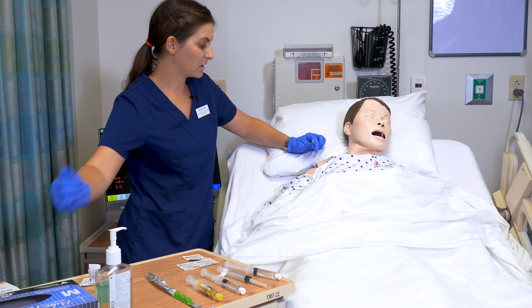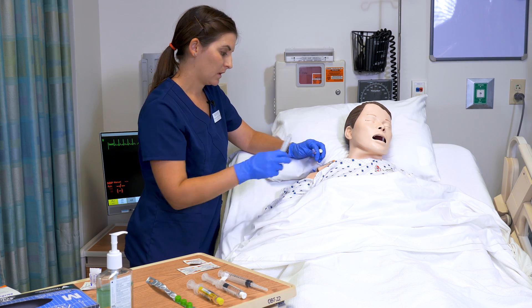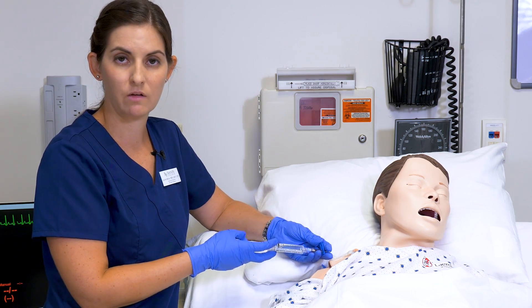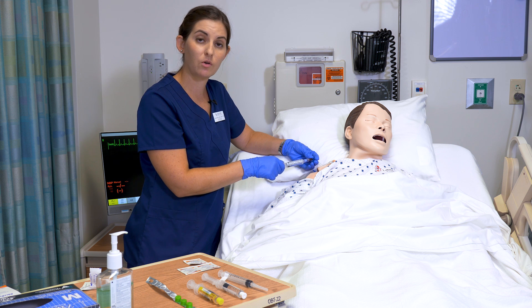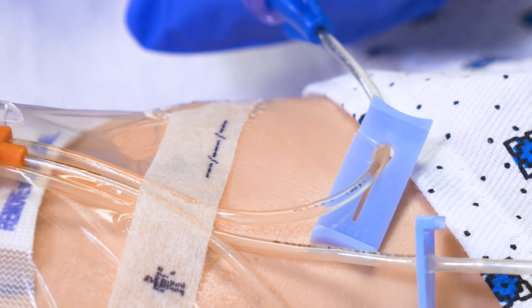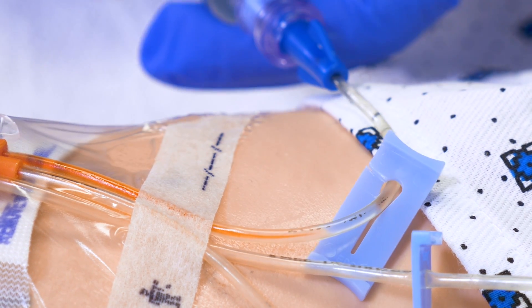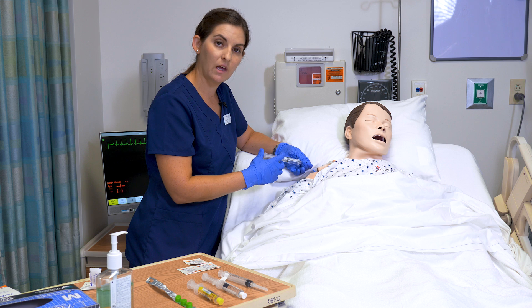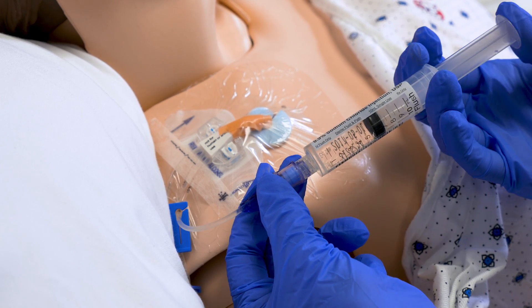Now that I've scrubbed the end of the needleless cannula, I do not want to touch it. I'm going to get my first saline and attach it. Before you flush a central line, you want to check for a blood return — this checks for patency. If you do not get blood return, follow standard protocols for clearing the line before use. I'm going to draw back my blood — I only want to draw back into the catheter; I do not want to contaminate my whole syringe. I do get a blood return, so now I'm going to flush my 5 mLs. For a central line, we typically use a push-pause method to clear the line, especially since I withdrew blood into it.